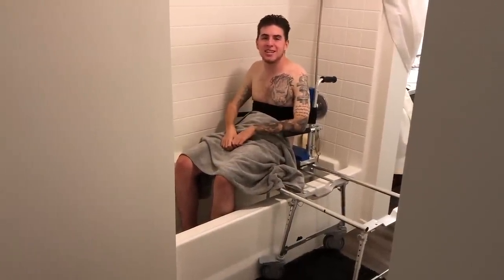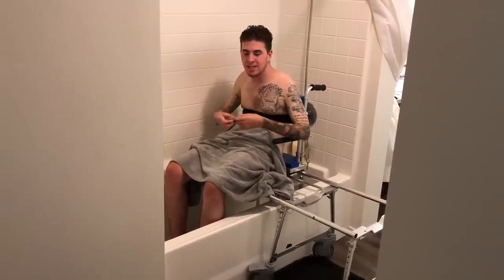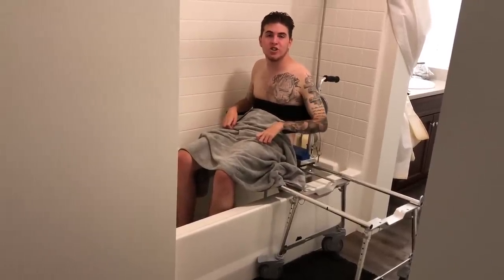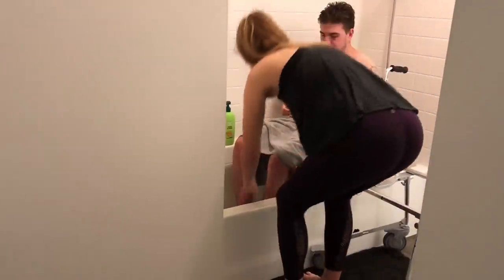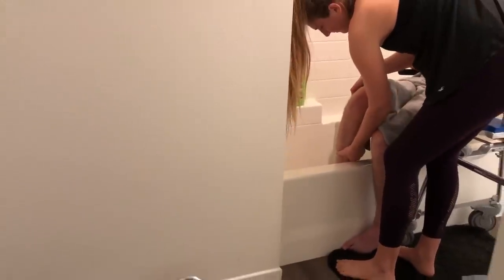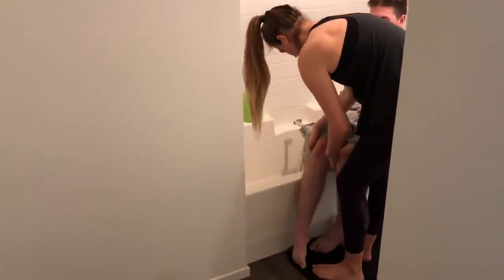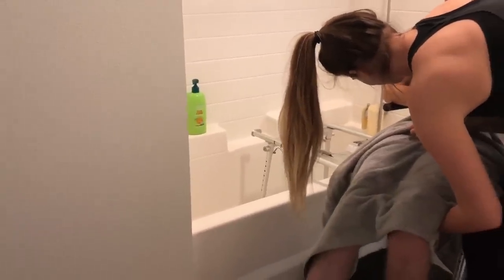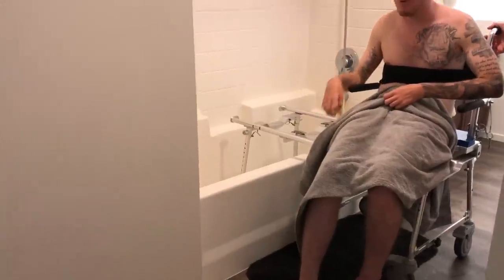So now I just finished my shower — I'm all fresh and clean, thanks to my wonderful girlfriend. We're gonna basically do the same thing just the other way, back onto the commode chair, and then we'll roll into my room and she'll transfer me onto my bed. She's gonna come around and help move my feet out of the tub. There we go, and now once we're all rolled over we've got to put the foot plates back on.